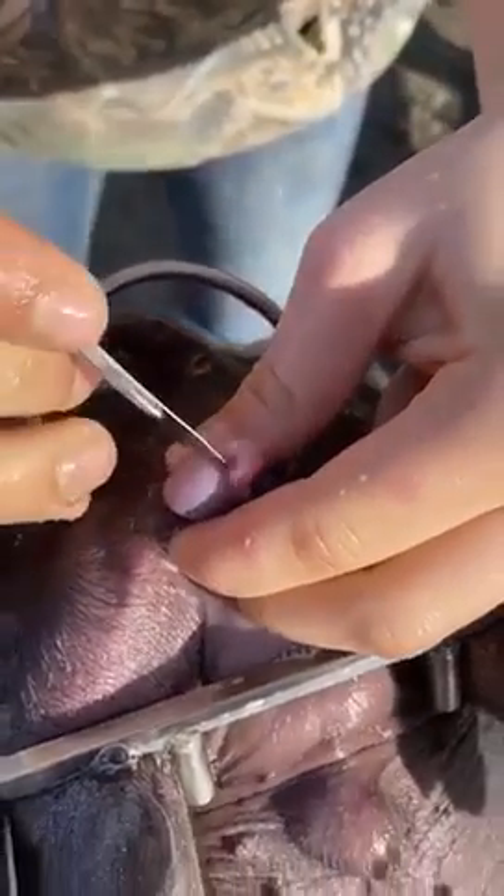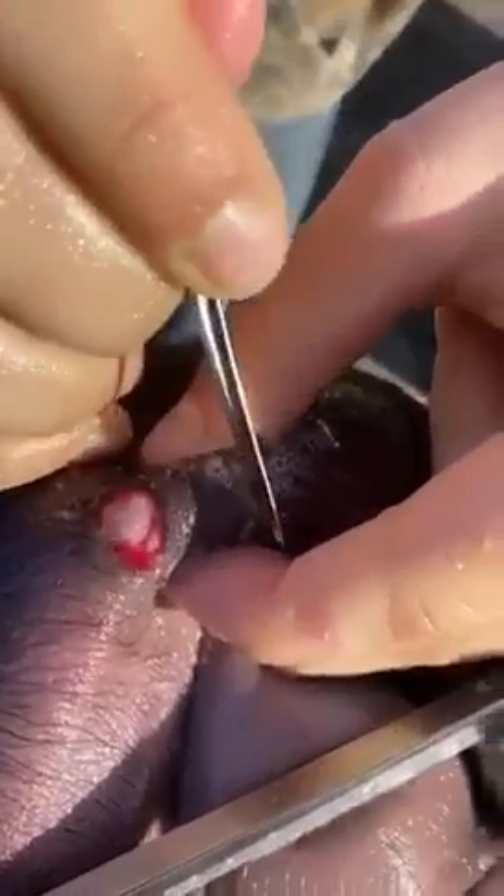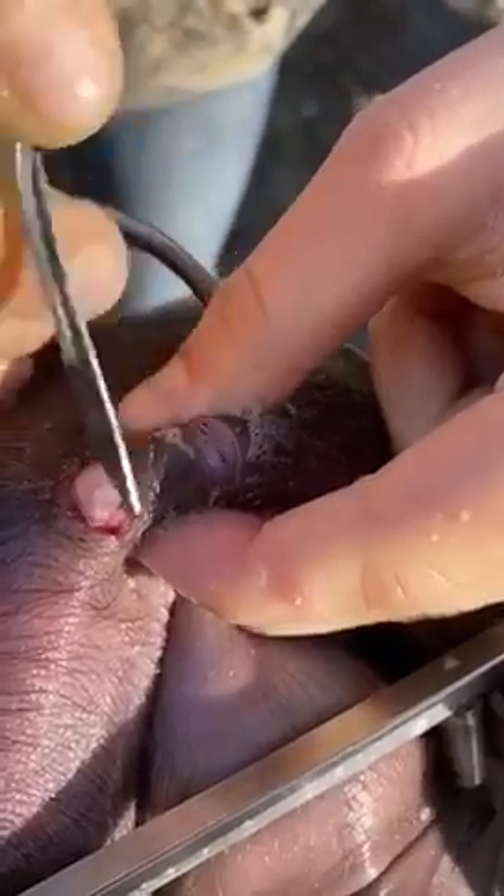Pop it out, then you can kind of twist a little bit and pull. Just kind of pull and scrape — do not cut straight, you just scrape it.